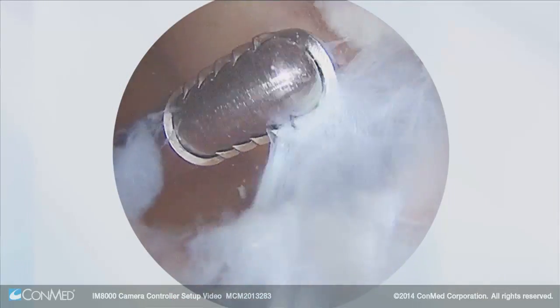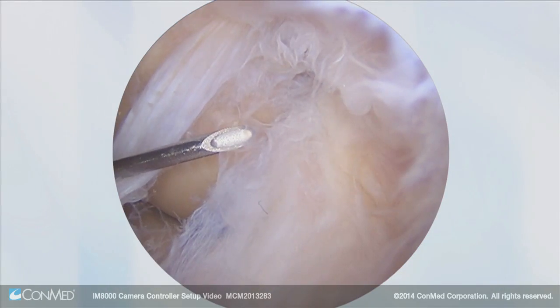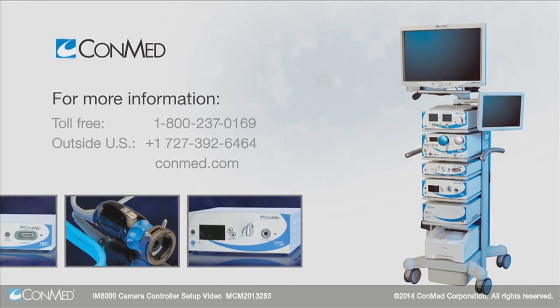The IM8000 presets and customizable features allow you to view an optimal image through many endoscopic procedures.